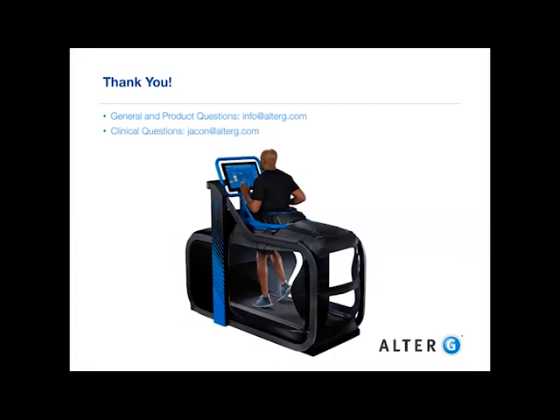Thank you. And it looks like our final question as of right now is, is it possible to train pediatric patients? Yes. Again, we have to consider there's a weight limit on the low end as well. If patients are too light, then we're not going to be able to get the calibration through the treadmill to provide body weight support. But we do have pediatric facilities that use the Anti-Gravity Treadmill, and we can always connect you with them if you want more information about an application with those patient populations.